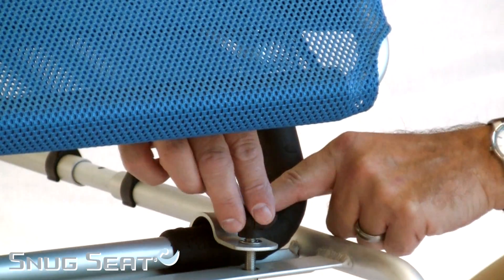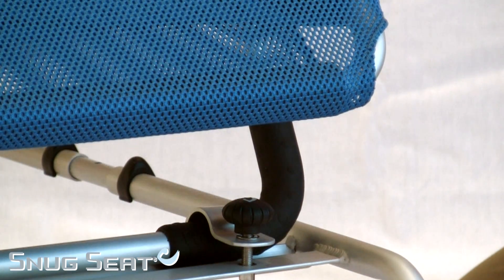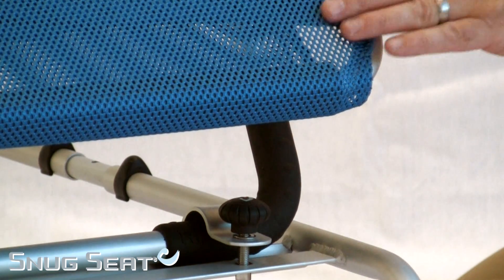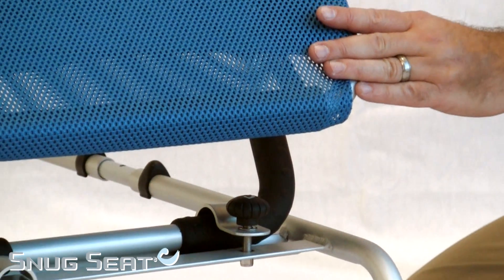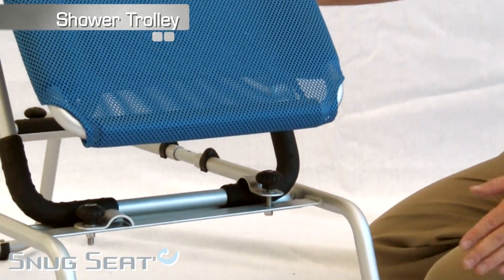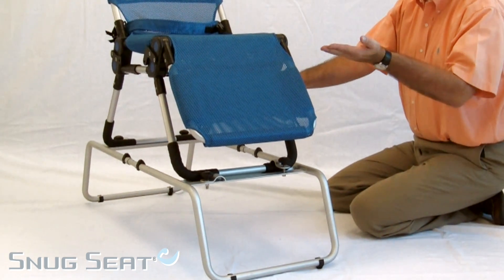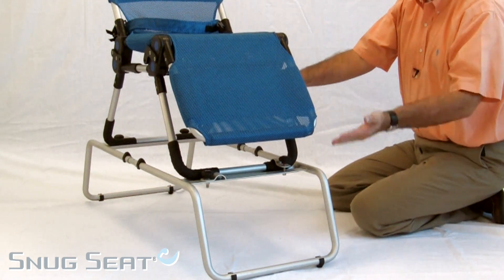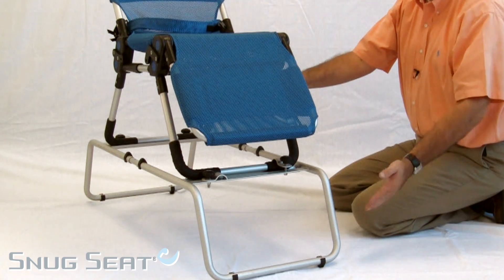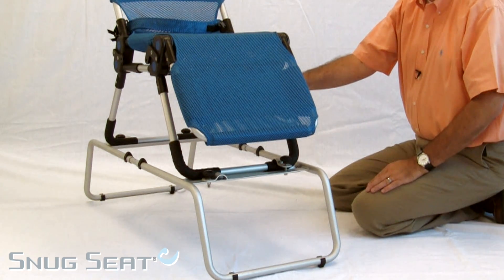Rotate the clamp in place and tighten on all four positions, providing a stable support for the Manatee Seat. We also have a shower trolley, which extends the height for caregiver support and comfort. It is a rolling shower product for those that have roll-in showers.